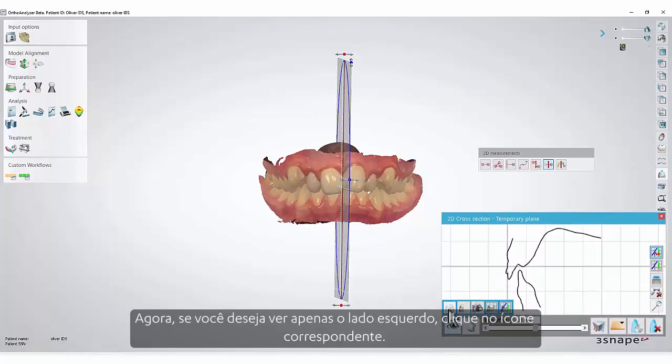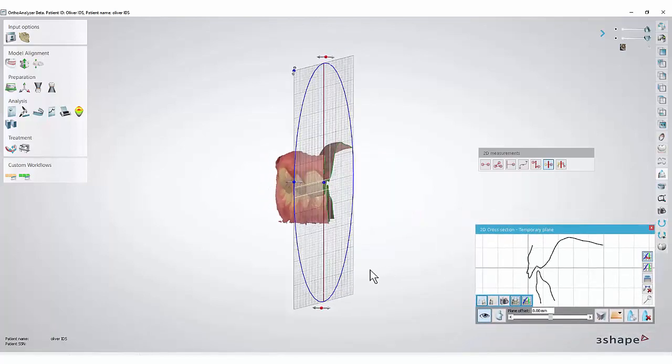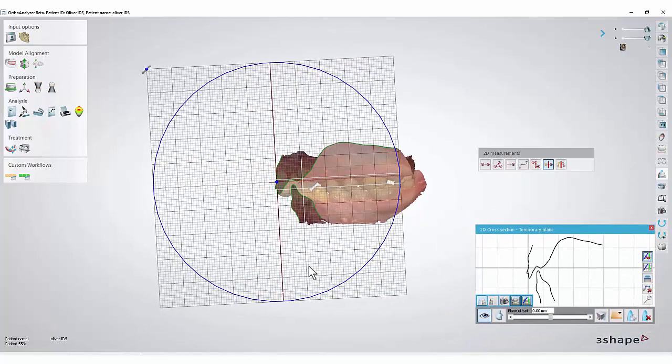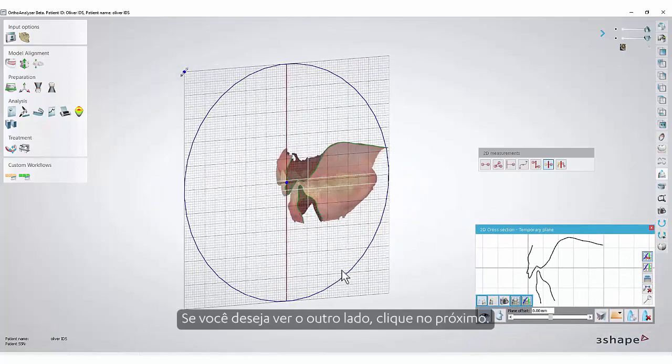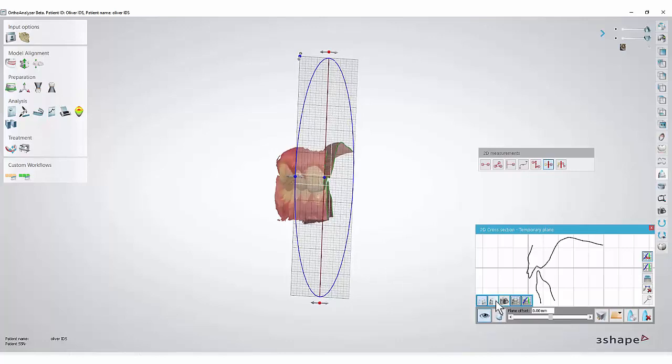Now, if you wish to see only the left side, click the corresponding icon. If you wish to see the other side, click the next one.